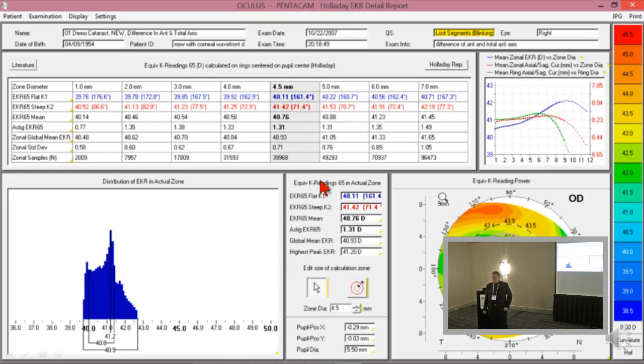If you had keratoconus, which this guy doesn't, but it's suspicious, he's got a bifocal cornea, what happens is it's like a bifocal intraocular lens. When you look at distance, you don't use the bifocal part, and when you look up close, you don't use the distance part. If you were to take a keratoconus patient, and usually they have a 4 to 5 diopter difference between the cap and the paracentral area, what you would find is if you took a reading card and held it at 20 centimeters, he could read that. And he does it through the cap on the cornea because it's like a +5 bifocal.